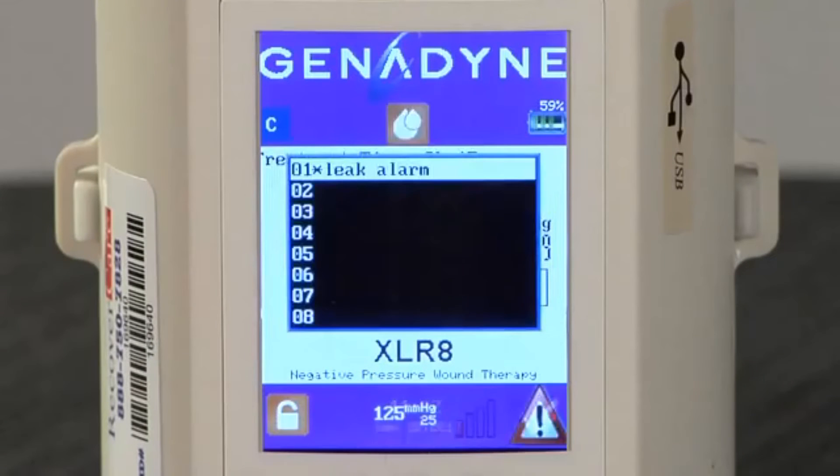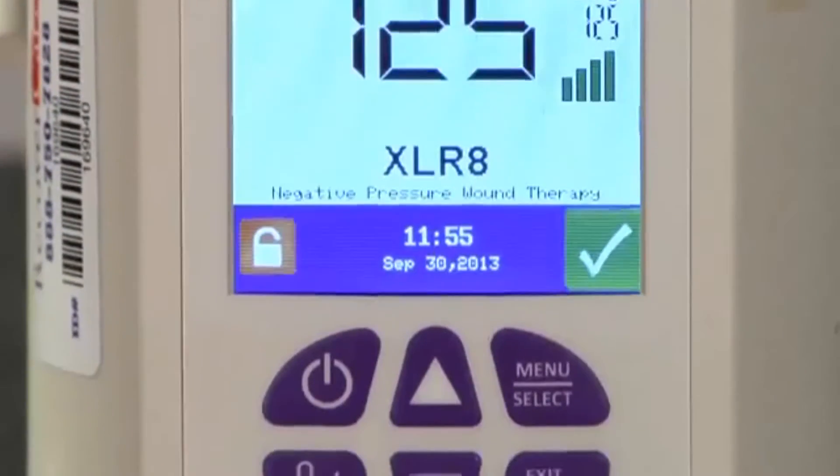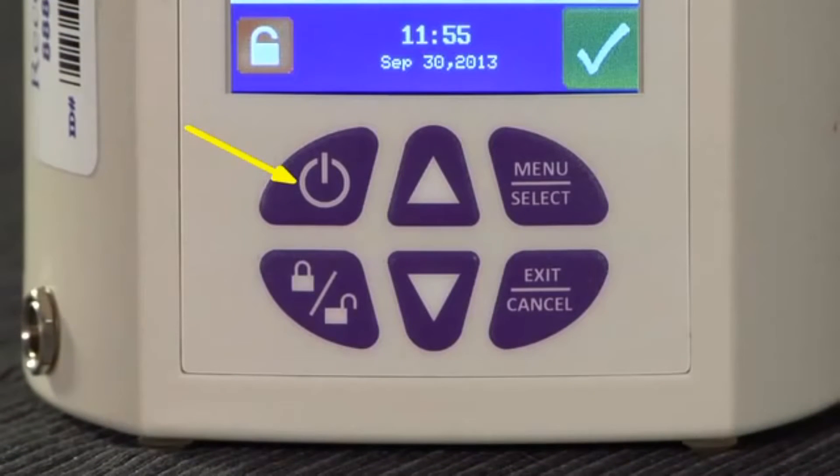Should an alarm be activated, the checkmark will be replaced with an exclamation mark in a red triangle. There are 6 buttons on the keypad used to enter pump settings. The on-off button is used to turn the device on and off. The up and down buttons are used to increase and decrease suction pressure. The up and down buttons are also used to scroll through screen menus. The menu select button brings up the system menu and allows the selection of desired pump functions. The lock-unlock button locks the keypad, reducing the risk of tampering with the device settings.